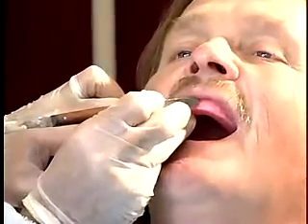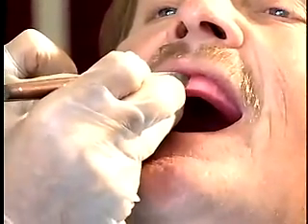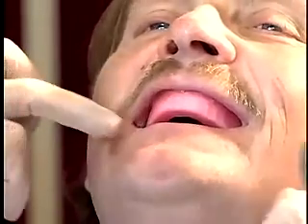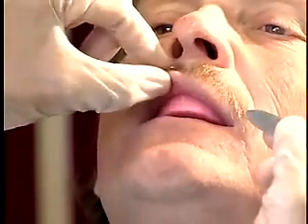Scribe the midline on the maxillary rim at this time to represent the location of the central incisors. Next, scribe the high lip line perpendicular to the midline as the patient smiles. Scribe the right and left canine lines at the corners of the mouth when at rest.